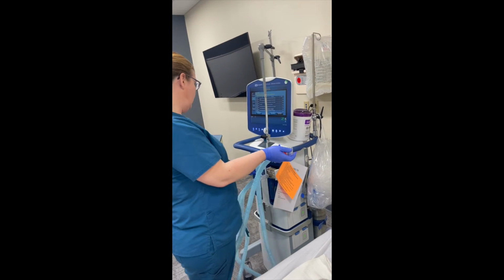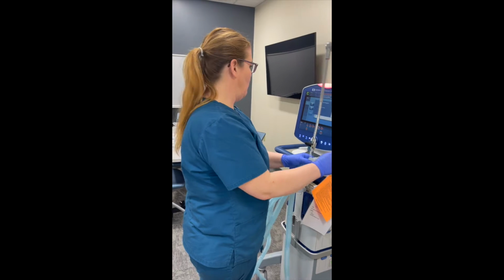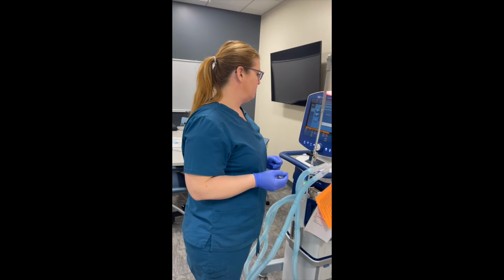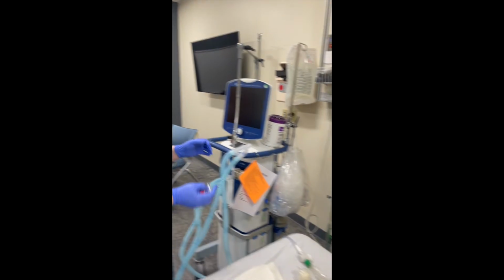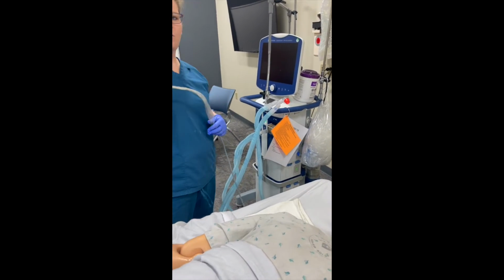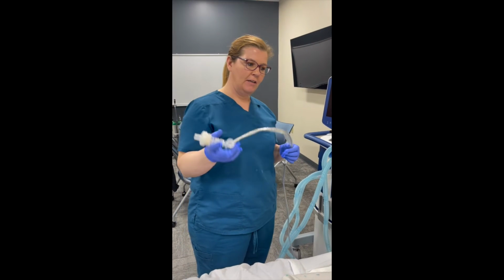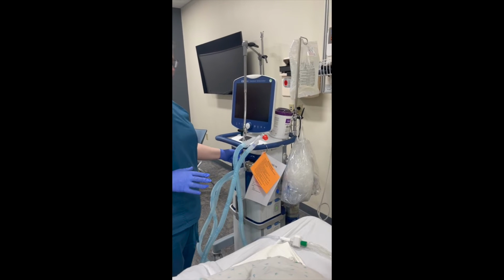Okay, so we're gonna go ahead and shut down the ventilator. Oops, sorry. All right, and then I'll set this here for a minute. Now I have my HME and my Ballard inline suction. So we're here at the bedside with the patient.